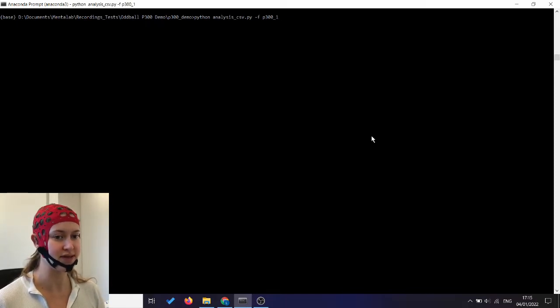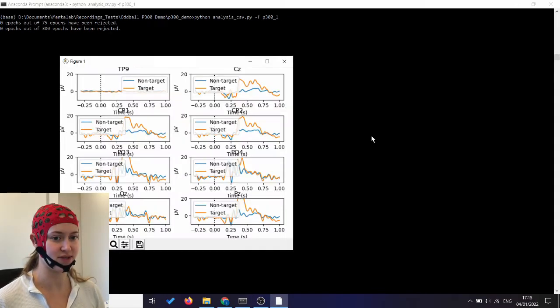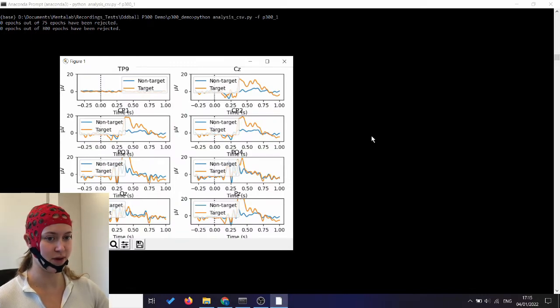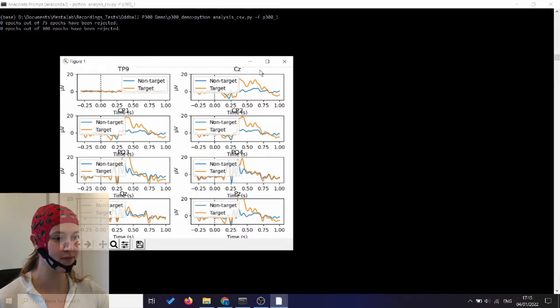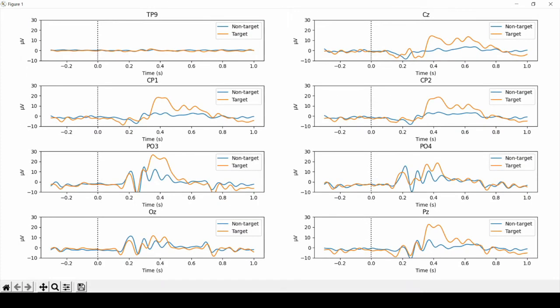So we're going to run this, and as we see, no epochs have been rejected as signaled here. And these are the plots that we can generate.